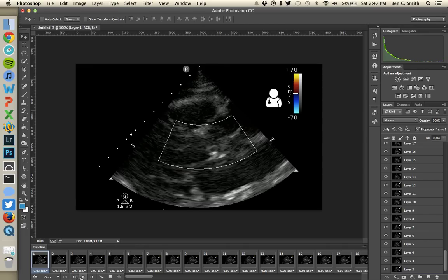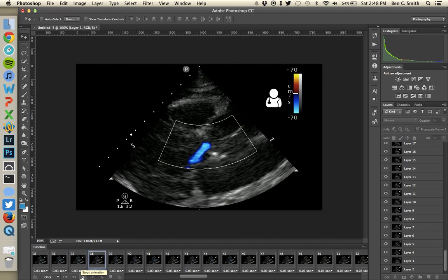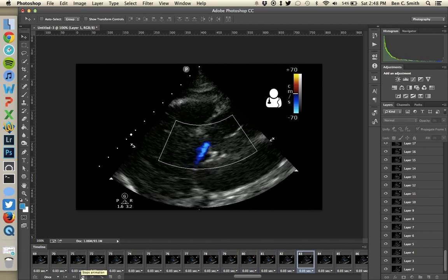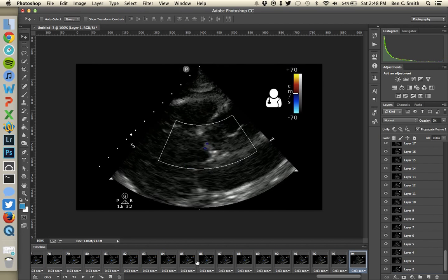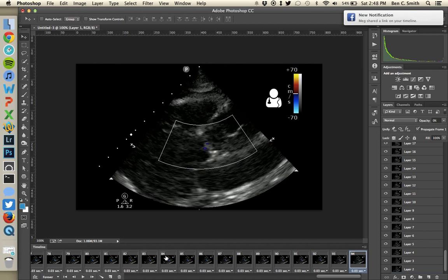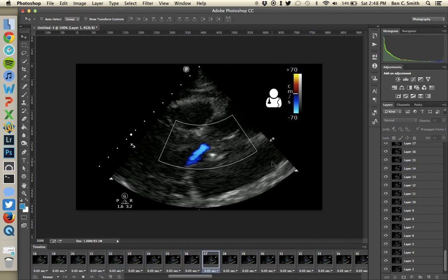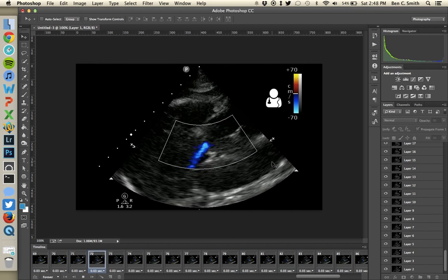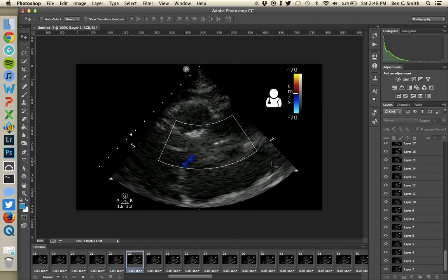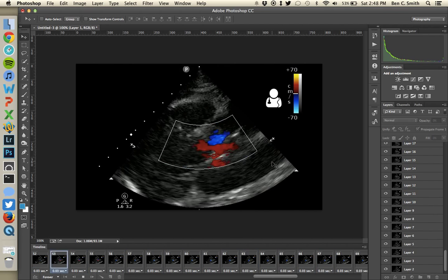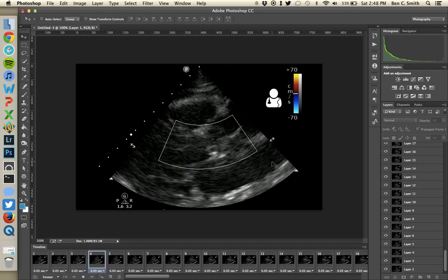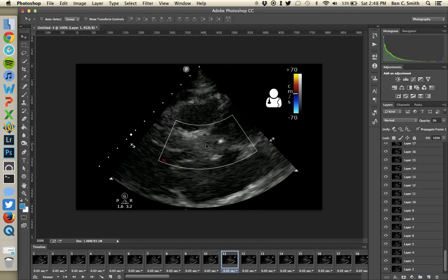You can hit play to see how your GIF is going to look. This isn't real-time speed, but it shows you how it's going to loop. I noticed it wasn't looping because I had 'Once' selected over here — you need to make sure you select 'Forever.' Now it'll loop around continuously. When it loops, it looks natural, like it's the same heart. Hit the space bar again to stop the video.